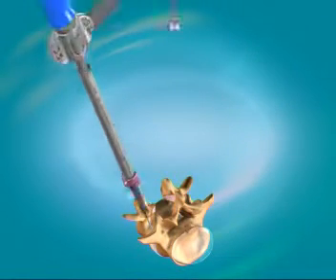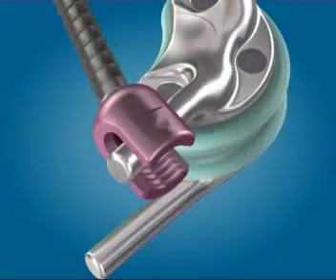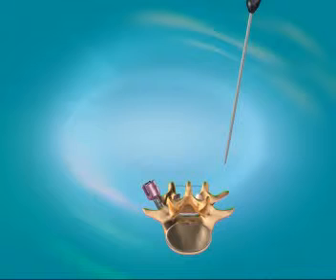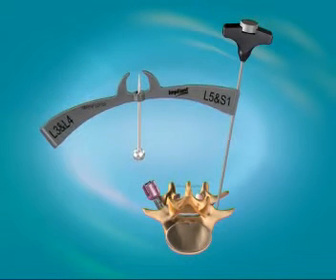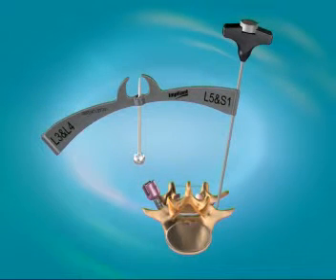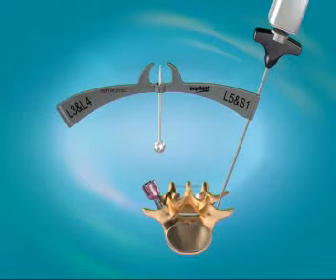If the pedicle screw insertion angle exceeds the compensation range of the polyaxial head, ± 20 degrees, the TOPS arm will not be properly attached to the pedicle screw. By using the K-wire, verify that you select the appropriately marked trocar pendulum for insertion. This instrument fits on any cylinder and can also be used with any pedicle screw path locating instrument.